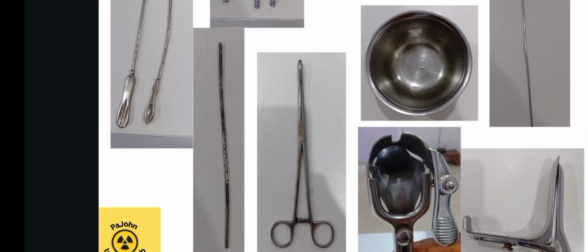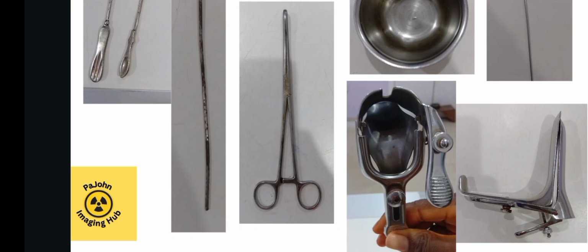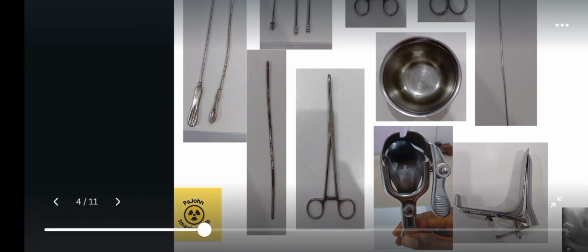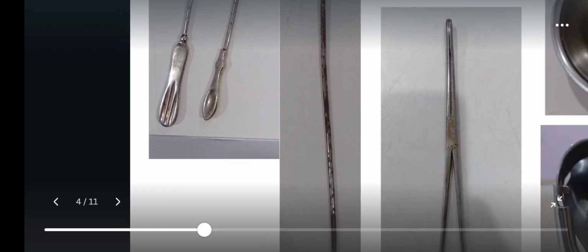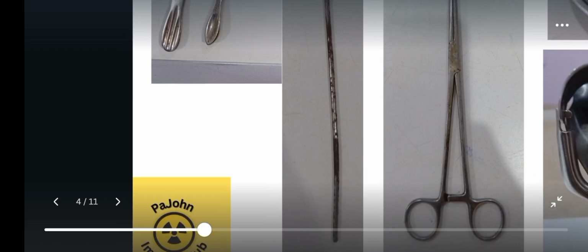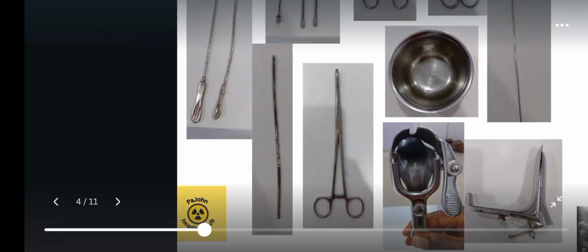Then this is a sponge holding forceps. You use it to grab cotton wool to clean the patient and some other things. Then this thing here is the dilator for patients that have cervical stenosis, or narrowing of the cervix. It comes in different sizes. We put it through the cervix gradually to dilate the cervix so that the instrument we want to insert through the cervix can easily enter.